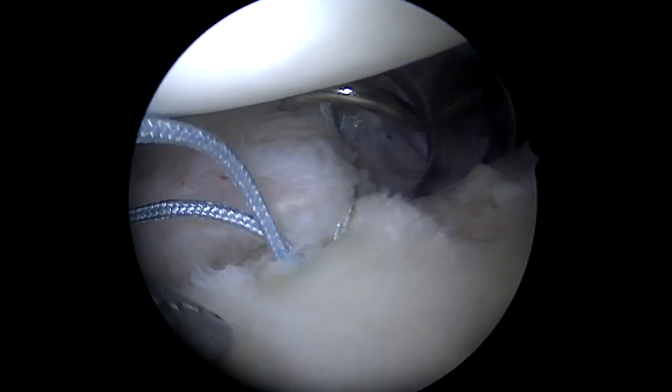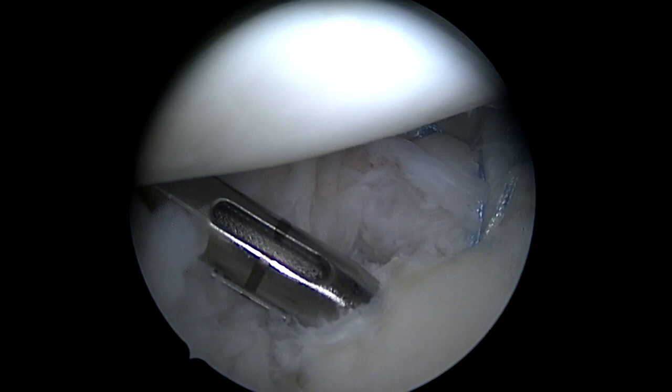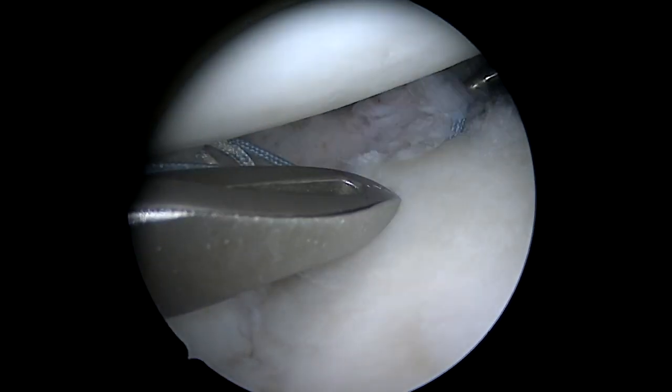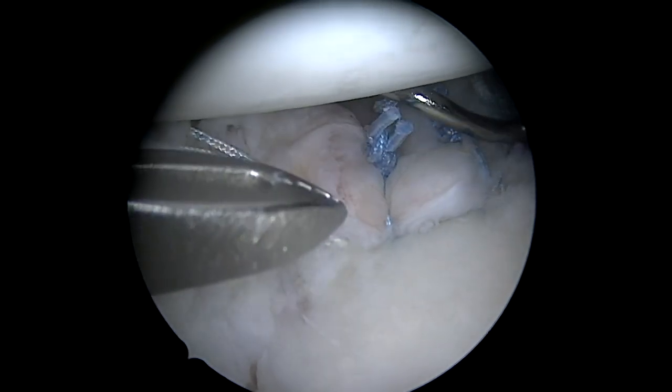The labrum is still attached to the fragment, so here I'm passing sutures basically below where the fragment is, repairing the labrum. This will help bring the fragment up and around, and then we'll place our screw once we have preliminary fixation through the soft tissue.